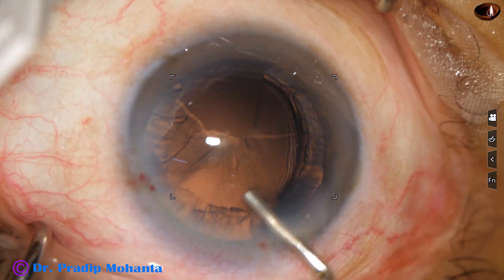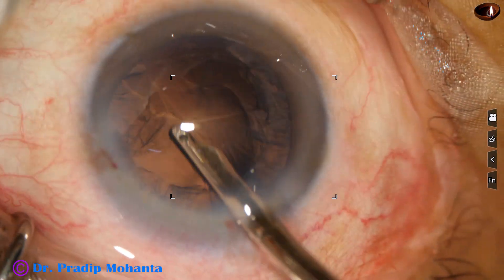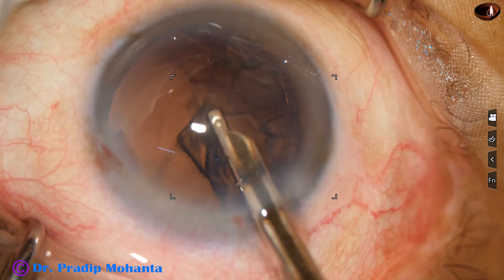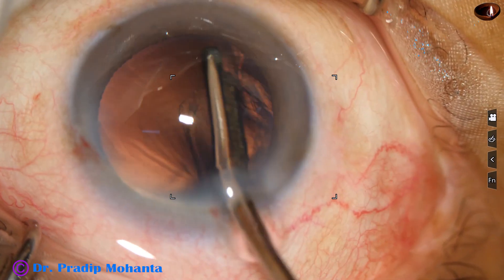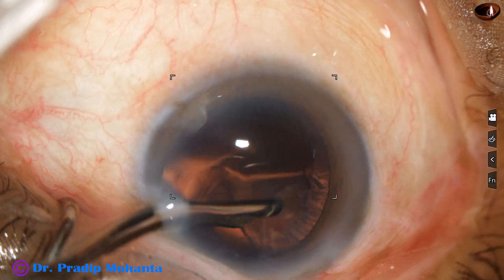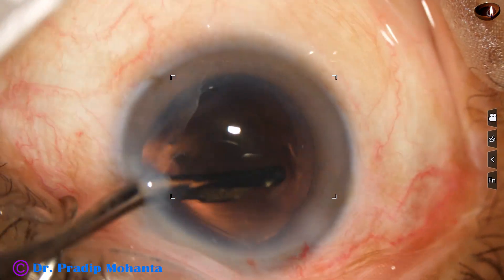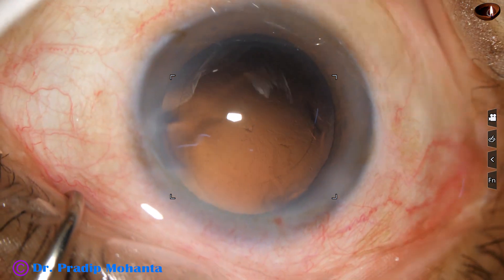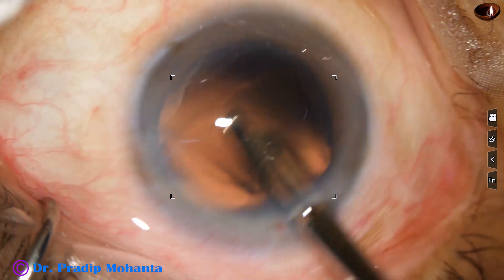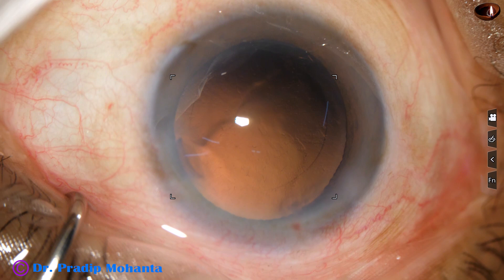And now the cortex is to be removed. I have removed a bit of cortex from 5 o'clock to 6 o'clock by the handpiece itself. The rest of the cortex is being removed by this 22-gauge Simcoe cannula. Going through the side port to remove the cortex from 9 o'clock to 11 o'clock. Some cells are still sticking to the posterior capsule and that has to be removed. A little bit of polishing has been done by the Simcoe itself.